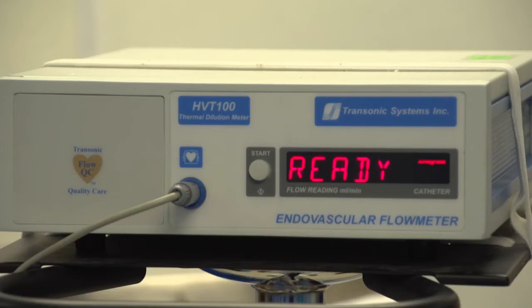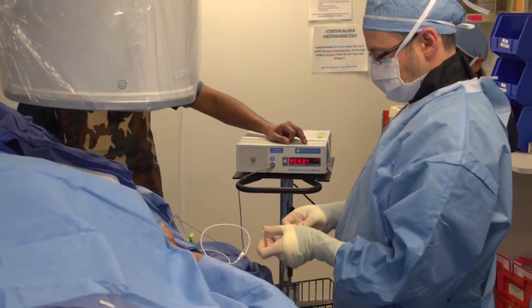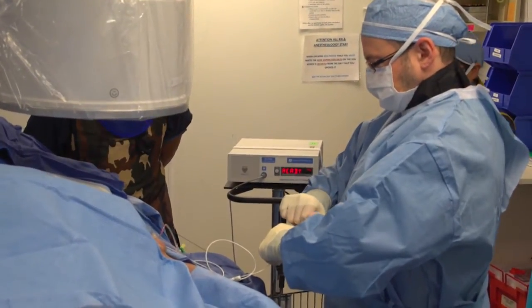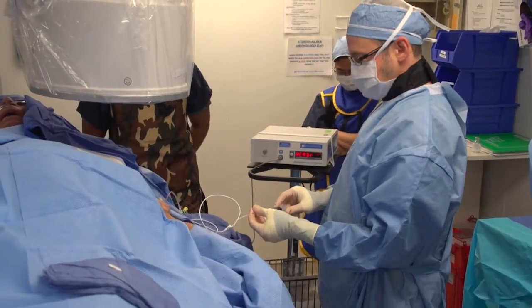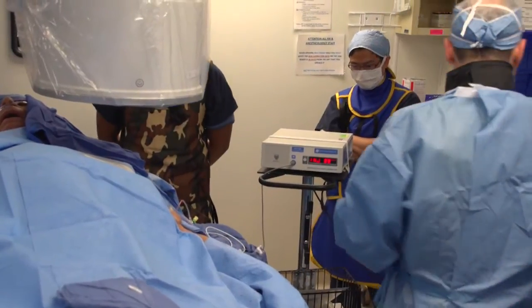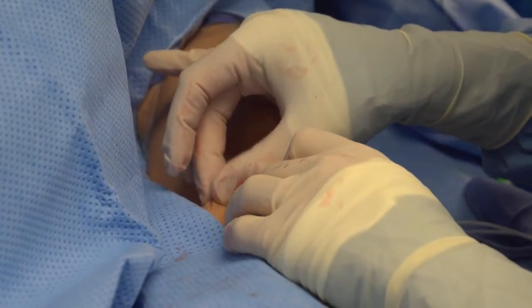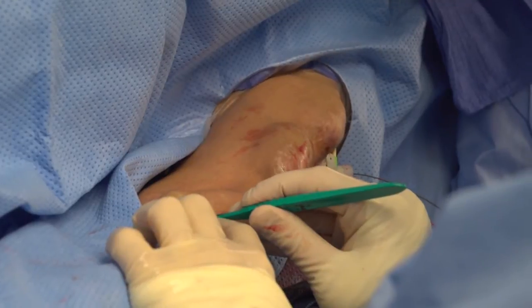First we obtain a flow measurement. We use a 10 cc syringe filled with saline and perform a forceful injection, then repeat it a second time to ensure accuracy. On the second injection you can see the patient is flowing at about 2,500 cc per minute, so our goal will be to decrease the flow by approximately 50%.